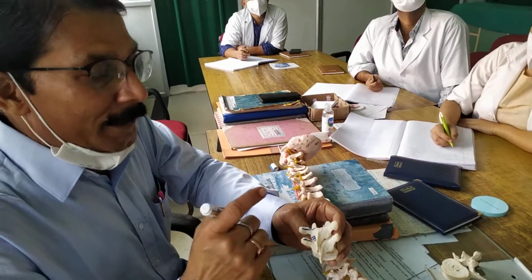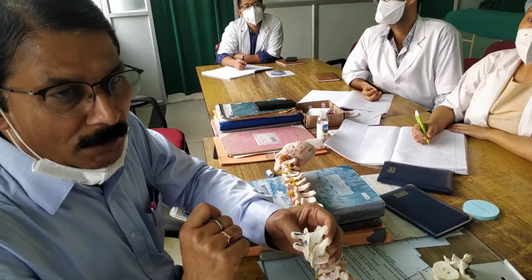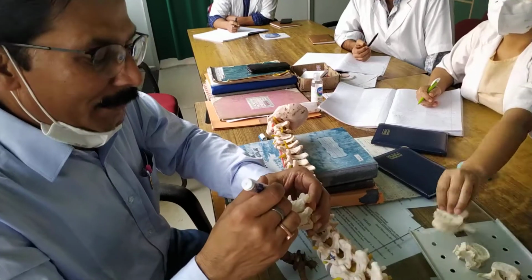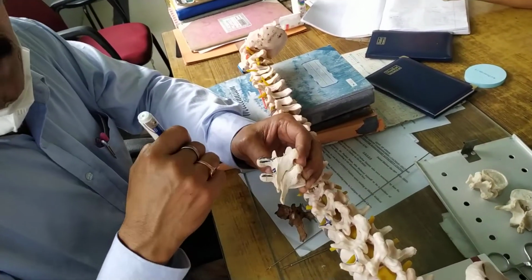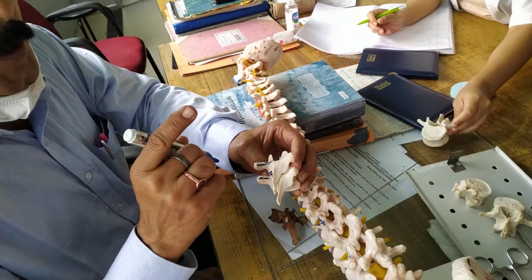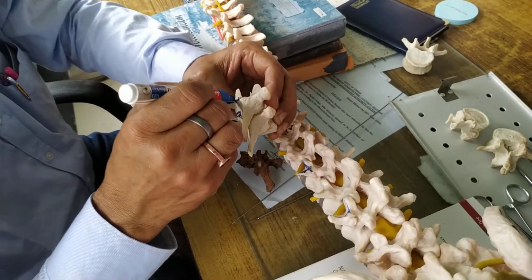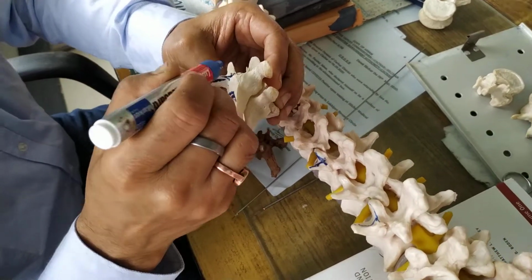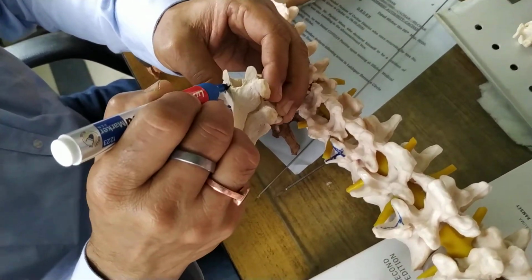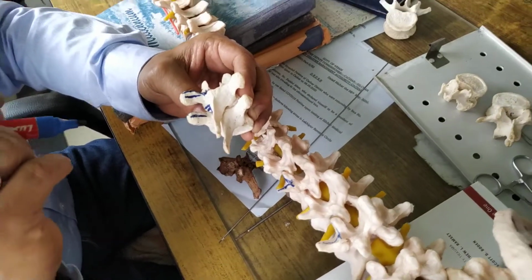Now the line joining the lower 2/3 and upper 1/3 is the line of importance for us. Now extend this line towards the medial line. Now find out the midpoint of the superior articular surface in this line. You are tracing this line there. Now this is your superior articular surface. Now find out the midpoint over here. The point where they intersect each other is the point of entry for us.